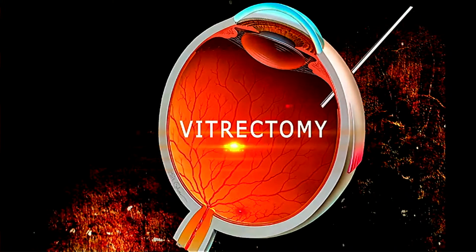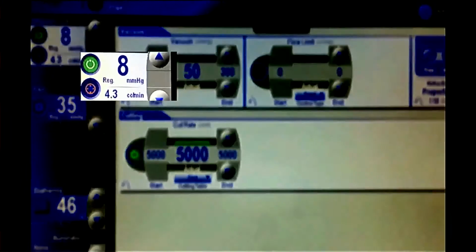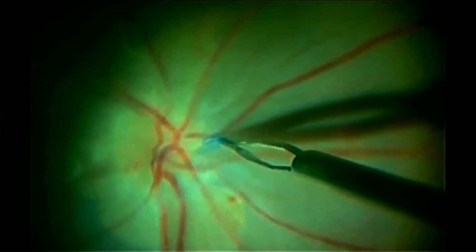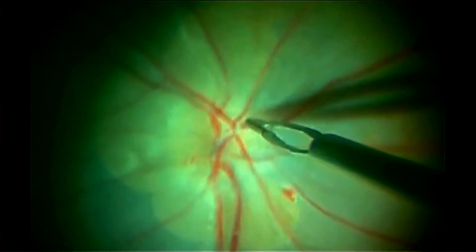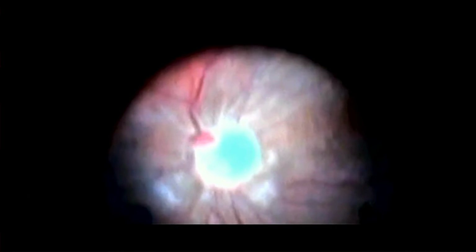Conceptually, we can achieve many goals by performing a vitrectomy as a treatment for CRAO. By performing a low IOP vitrectomy, we can achieve a long-term hypotony not only intraoperatively but also post-operatively if we leave the eye hypotonous at the end of the surgery. Massaging the central retinal artery can also help dislodge an embolus if present. If necessary, the central retinal artery can be nicked to remove the embolus.